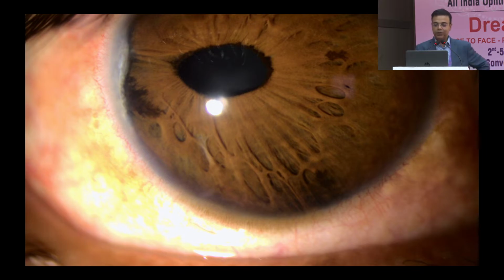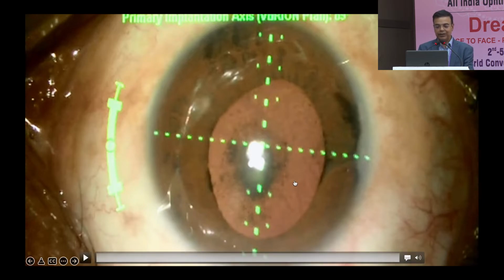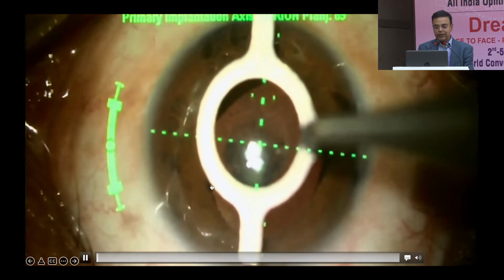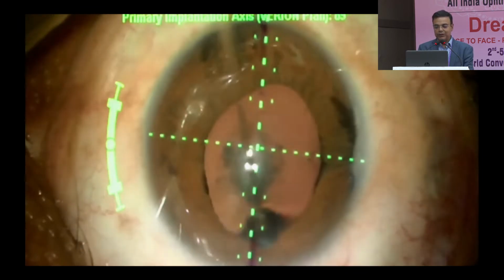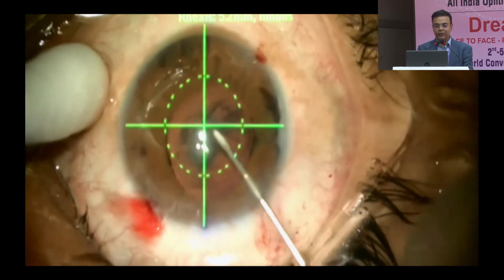This eye had poor vision since childhood and had a pupil which was mostly peaked towards one side, and we had to go ahead and operate him, and had to put a multifocal because he had a good multifocal, and there was good visual potential in this eye because his previous records showed that he had fairly good vision in this eye, in spite of the fact that he thought he did not. So once the pupil was dilated, it looked much better. We decided to put a toric multifocal for him, but then we had to do something about the pupil as well.